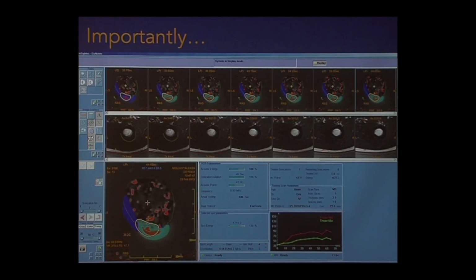This is that same screenshot that I showed you earlier, and this was this particular patient. You can see that we were able to get great heating within that tumor, within that nidus. You can see right here, I don't want to cover it up, but in this area where we have our color overlay, we get great heating at the edge of the bone. That's exactly where we want our heating to be. And I think it was the 7th sonication when we felt like we were done. So 20-second sonication, 7 of them, and the patient's tumor was treated. His pain that he had had for a year resolved within 3 to 5 days. And he has not had pain since. I still keep in close contact with him, and he's doing really, really well.